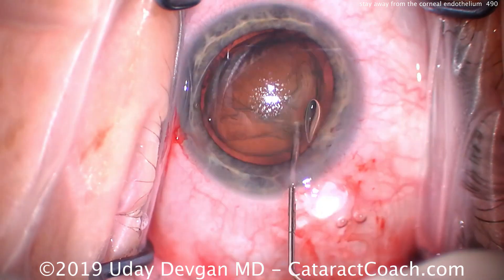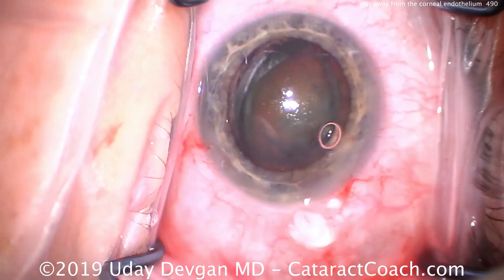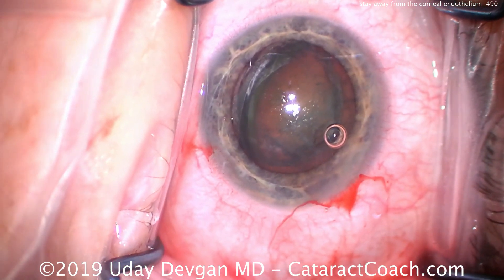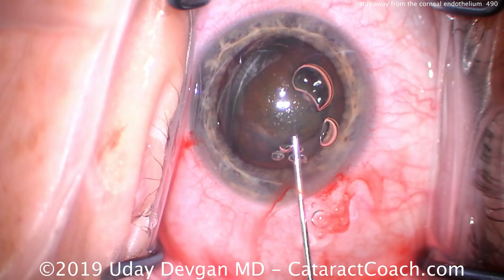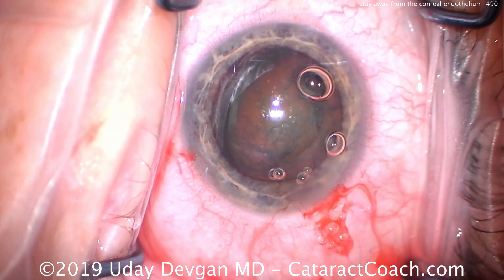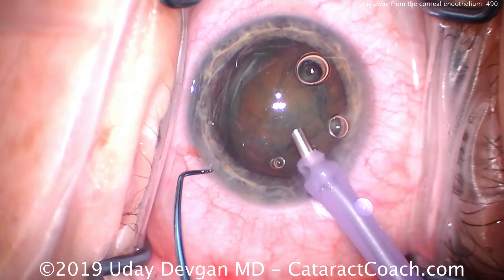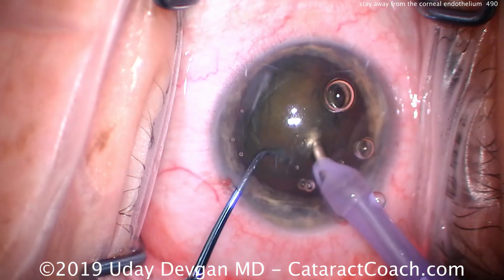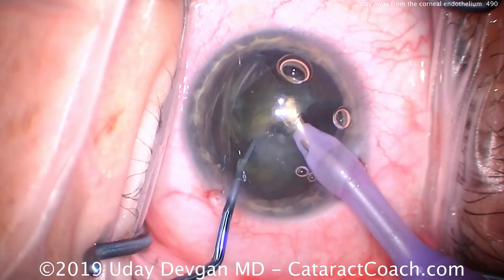Let me show you this case here. We'll do the hydrodissection — it looks pretty good, good rhexis. We're losing a little viscoelastic, but we have a nice central coating of dispersive viscoelastic against the corneal endothelium. We'll put a little more in right there. That's protecting the corneal endothelial cells, so when we do our phaco chop, we know the corneal endothelial cells are safe.